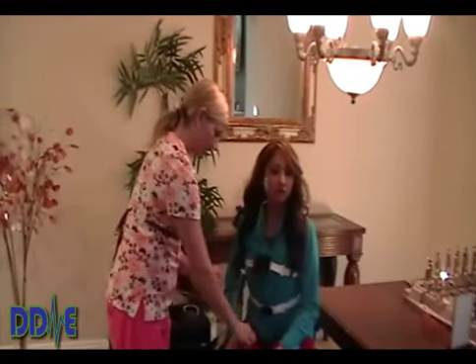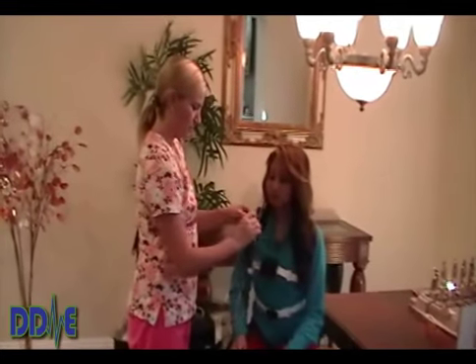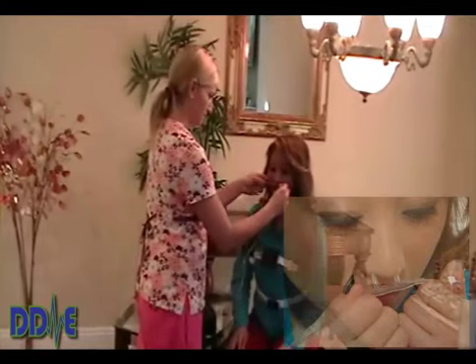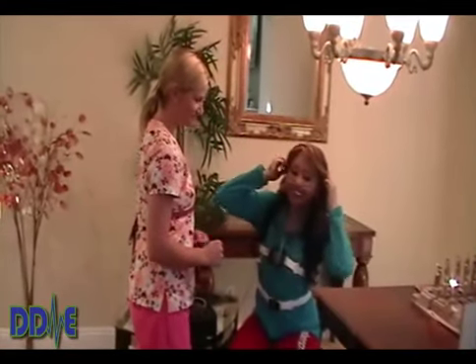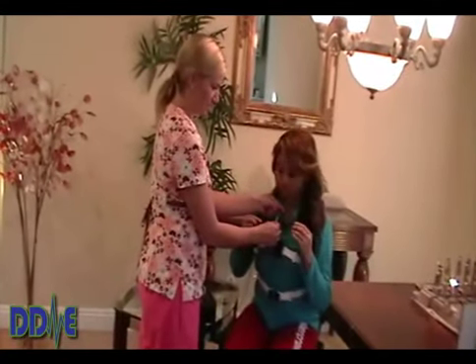The next step is the cannula. Be sure patients understand that when you place the cannula, the tubes go in the nares, the tubing goes up over the ears, and then gently tighten the cannula underneath the chin.